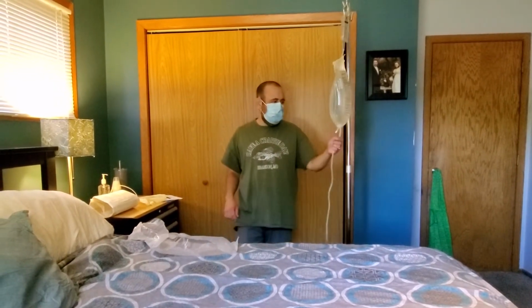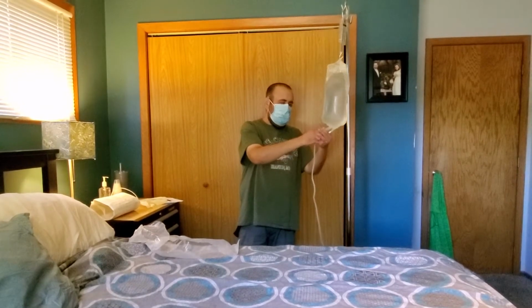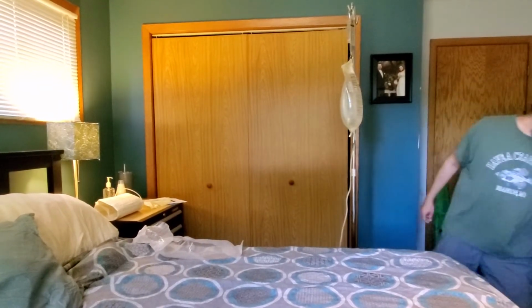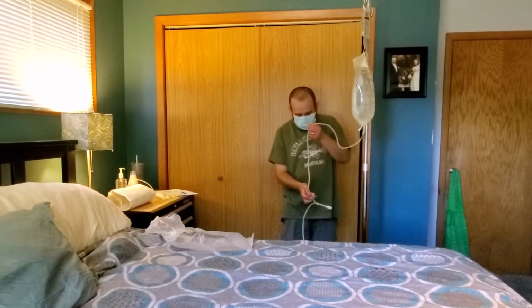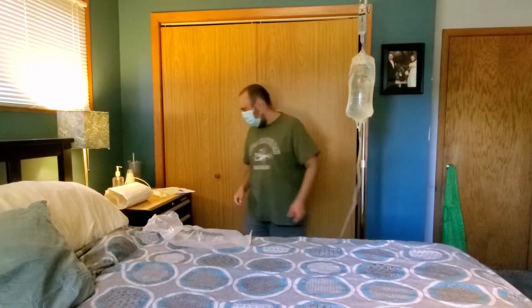Once that's done, you can break. There's a little plastic piece in here. Don't you need the clamp? Yes. Then you would put clamps on before doing that to make sure you don't leak everywhere. You're welcome. And right now this only needs one clamp.